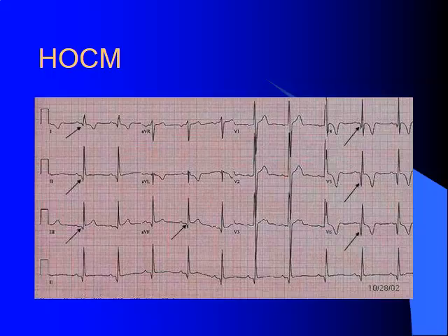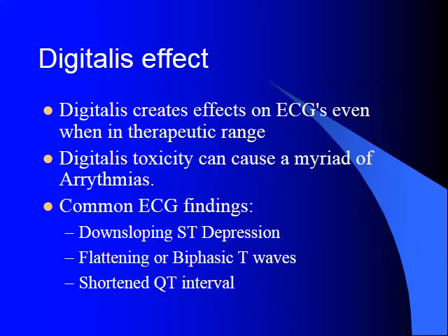Just note, the biggest thing we're going to note here is the left ventricular hypertrophy-like complexes with the extremely large QRS complexes in the anterior leads. If you look, our QRS complexes are actually buried in each other with pretty significant amplitudes. So this is going to be a finding that we'll see usually in younger adolescent patients, and it is cause for a cardiology consult.